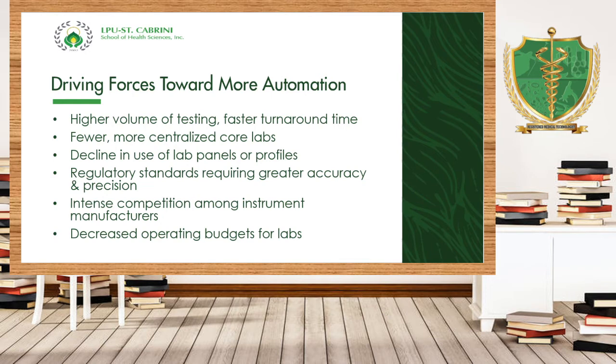Next is fewer, more centralized core labs. Mas madali yung ginagawa mo. Centralized ka na. No? Isang machine ang ginagamit mo for all the tests. Declining the use of lab panels or profiles. Ano ba yung mga lab panels na yun or profiles? These are the tests that are being used to assess, let's say for example, liver profile. If you're going to do a profile at once using a conventional technique or the manual technique, na masyadong matagal.